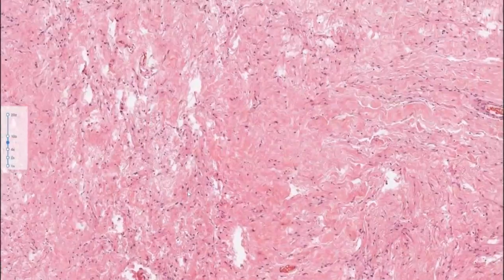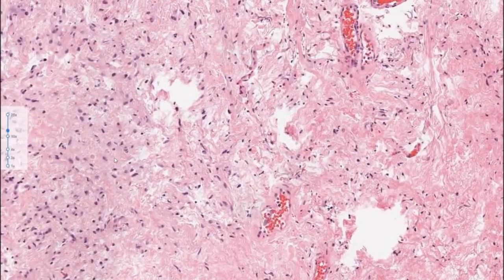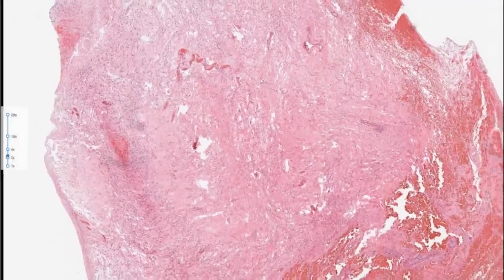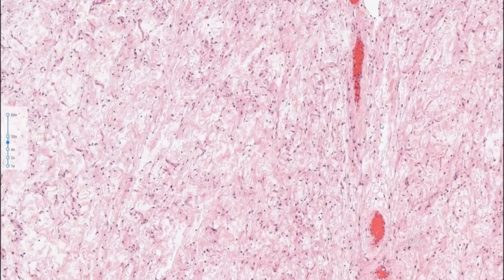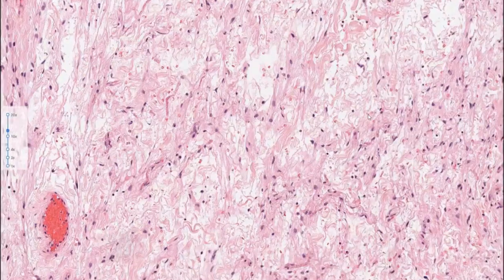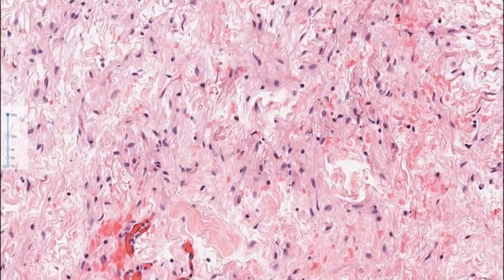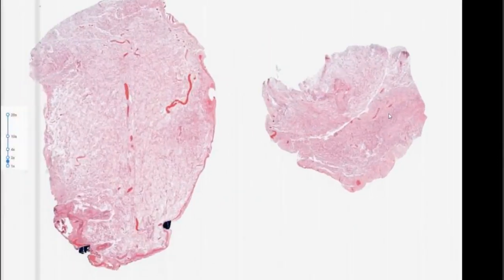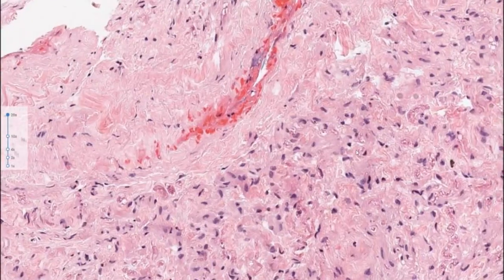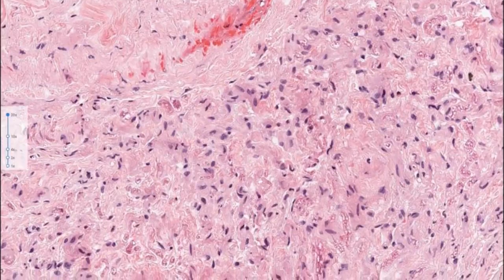And you can see a bland proliferation. Some cells that are wavy to oval. Some collagen, a few delicate fibers. And in areas like these, it starts making you think of neurofibroma, of course, as your first interpretation or the first diagnosis that comes to mind. You have here some axons, evident actually by H&E. Important to recognize axons on H&E when they appear. This can be mistaken for other structures.